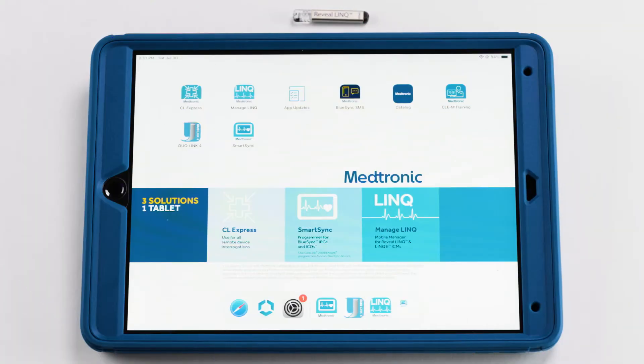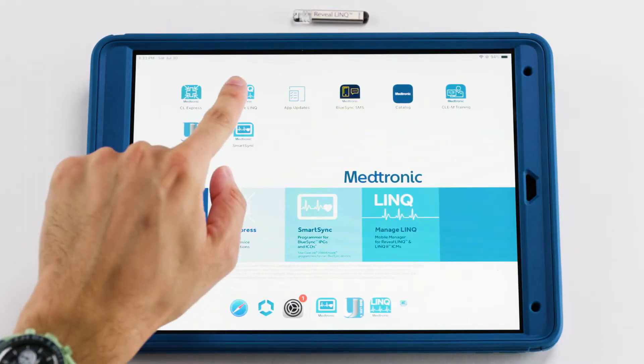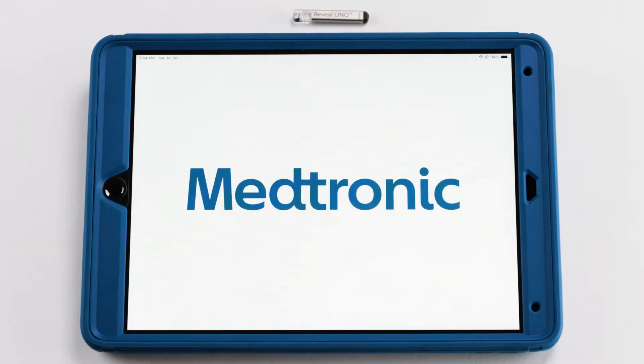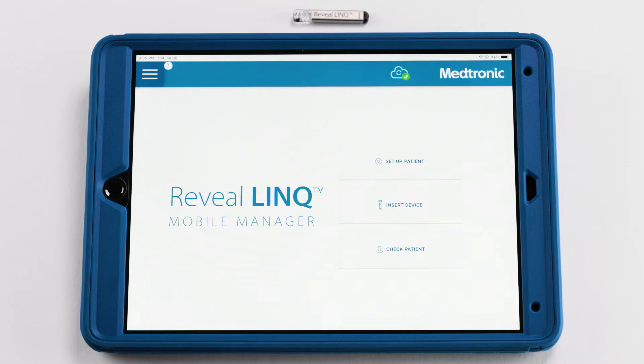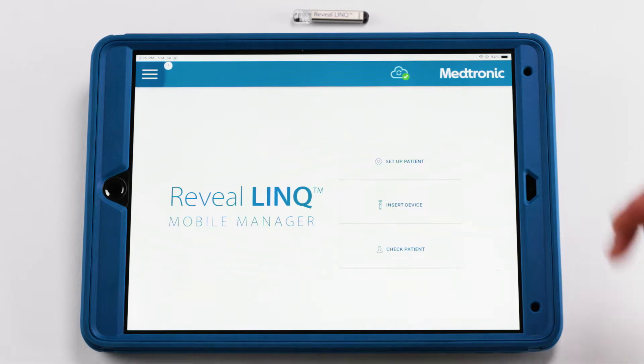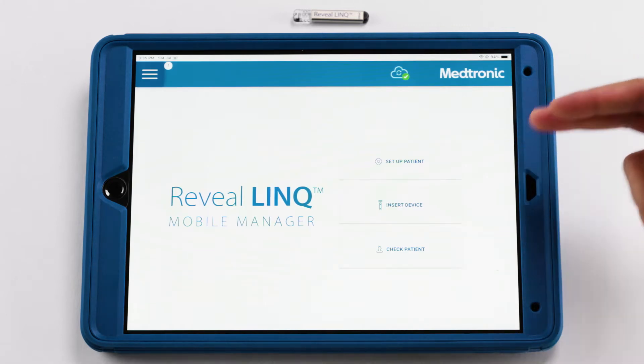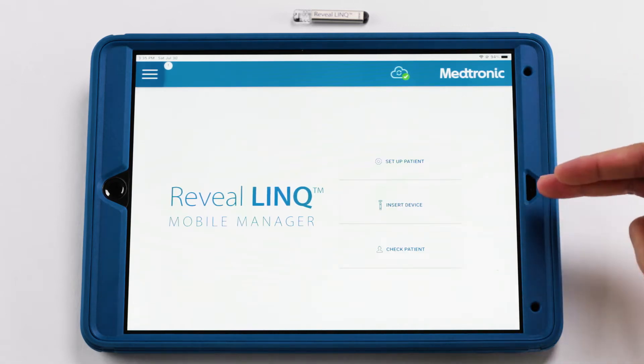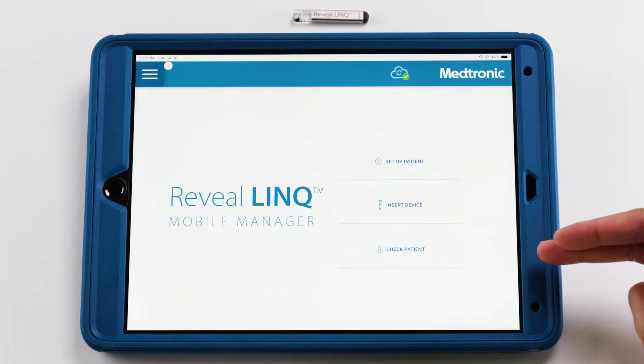When you open the Medtronic RevealLink Mobile Manager app, the RevealLink Mobile Manager has three main tiles: Setup Patient, Insert Device, and Check Patient.